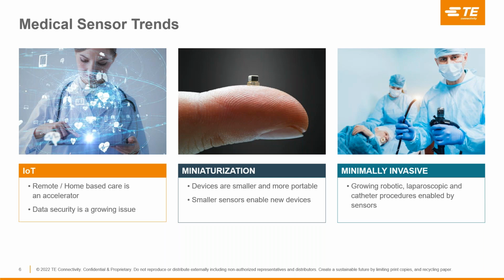Kind of playing into the next trend of minimally invasive. So, growth in things like robotics, laparoscopics, and catheter procedures are all enabled by sensors, and really minimally invasive means quicker recovery for the patients and ultimately drives down the total cost of care within the market. Next slide.